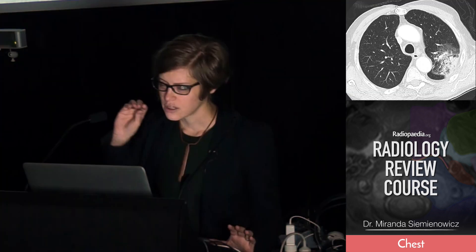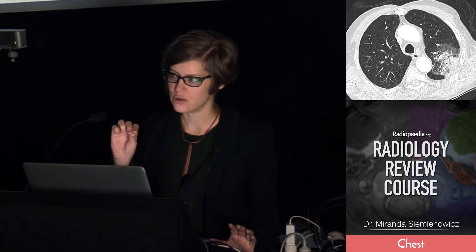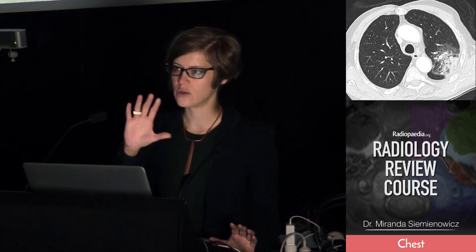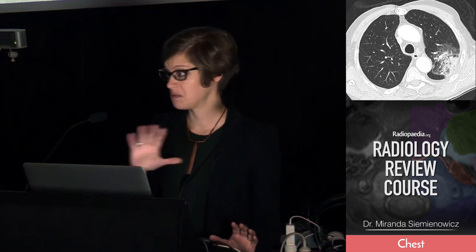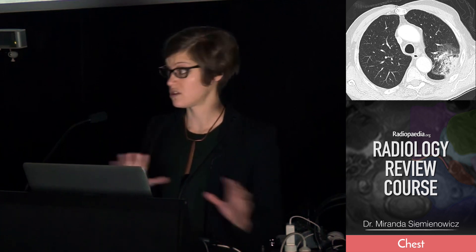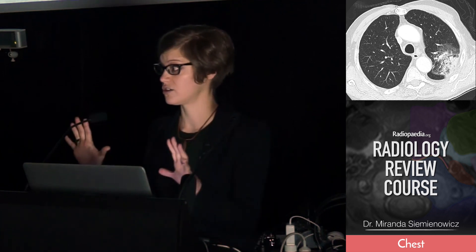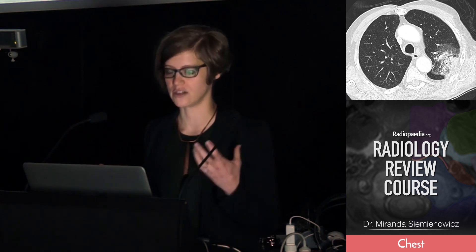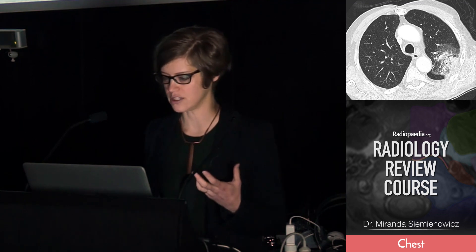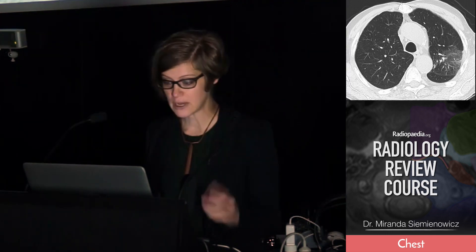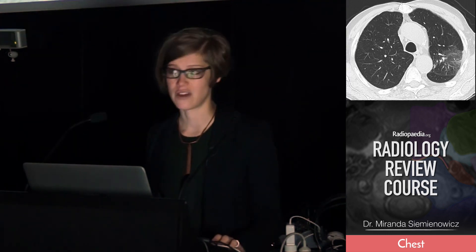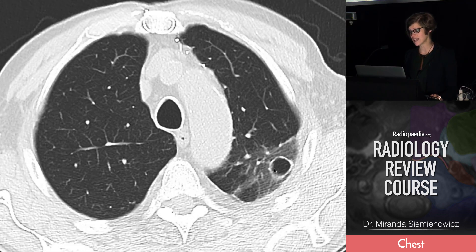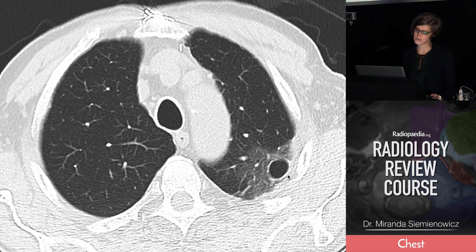So if it's cavitation within what is otherwise segmental consolidation and ground glass opacity, you've got to think about infection as the underlying process. In this patient, they go on to have antibiotic treatment. This is a CT six weeks later — a little pneumatocele from healing infection.